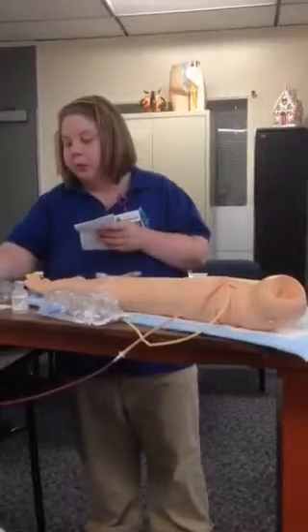I'm Nicole Walters. In Section 4, I will be demonstrating IV medication administration via minibag. I will first check my doctor's orders.